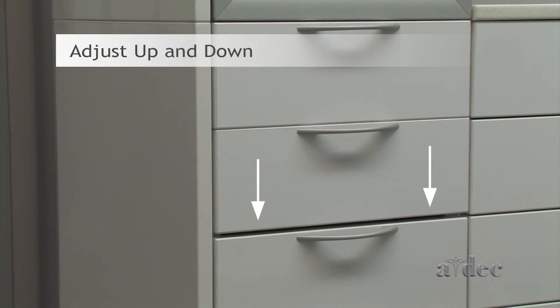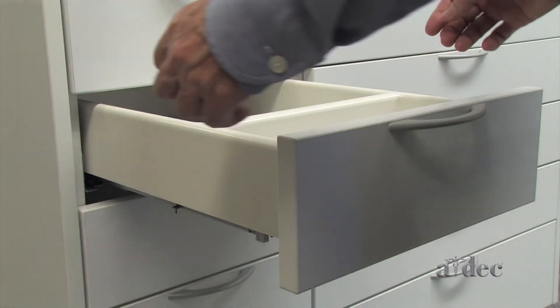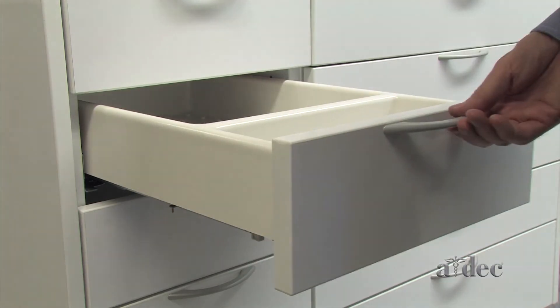To adjust the drawer face up and down, slide the gray tab on the side you are adjusting. Slide the tab towards you to lower the drawer face.